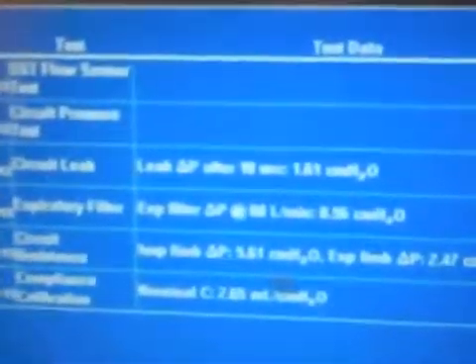Unblock the Y, and my SST is complete. You can see I've passed all my categories. Those numbers that are calculated for leak, expiratory filter, resistance, and compliance will now be saved.